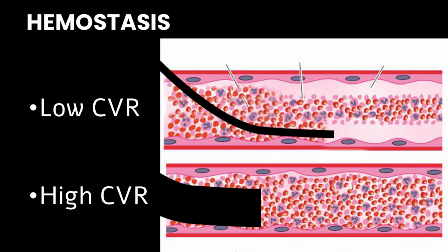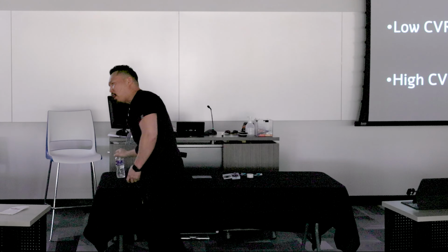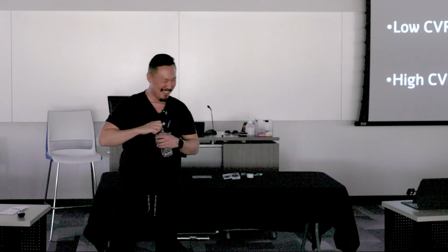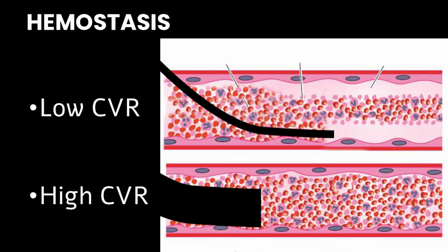Catheter-to-vein ratio matters. In the ER, we used to tout bigger is better. Put in the biggest vein, yeah, 18 gauge in the pinky. That's awesome, you're great. No, you're wrong. This is why. When we put in the larger catheter unnecessarily, if they need it, the treatment comes first. But if they don't need it, why did you put that 18 in that pinky?